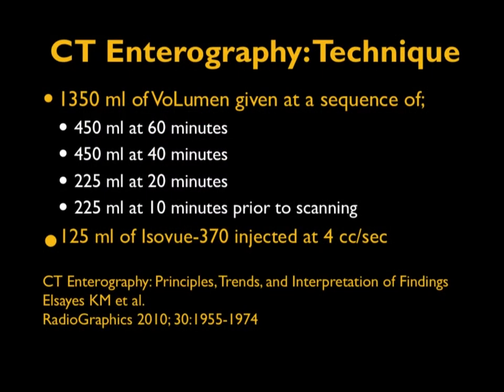I'll just comment on volumen. Typically, we'll use 3 bottles given over about a 1 hour period. We'll then give water. Some people use, so you can see for us, it's 900 cc's of volumen and 450 of water. There are a lot of different protocols. Here's one of the protocols by Elsie.